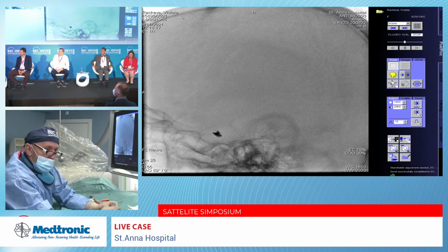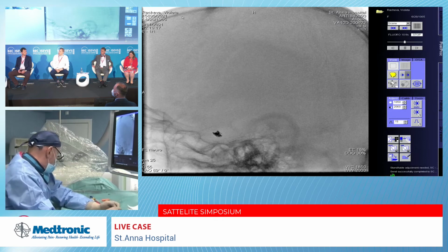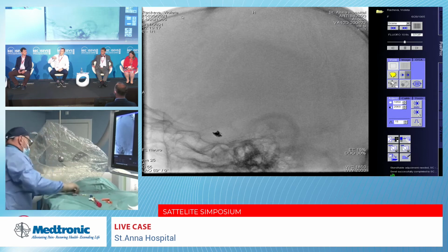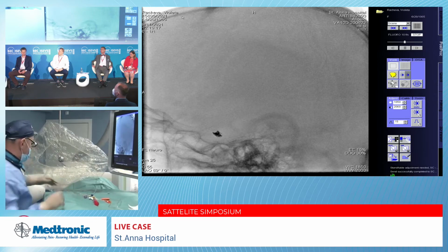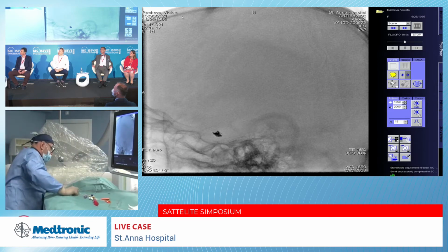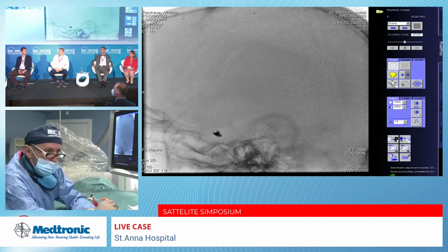I'm curious regarding proliferation. How often do you see proliferation in a flow diverter stent? In the old versions of the flow diversion, without coating, just the standard flow diversion, we have less than 5% observation at the 6 months control, and if we do another follow-up at 1 year, after that only on the aspirin, it's completely gone. And what if you have critical stenosis within the flow diverter? In my experience, I never saw it until this moment.